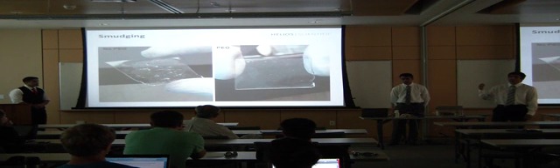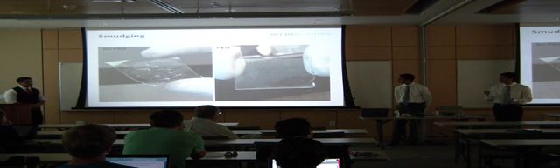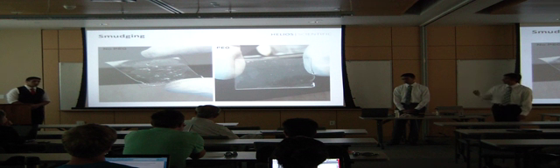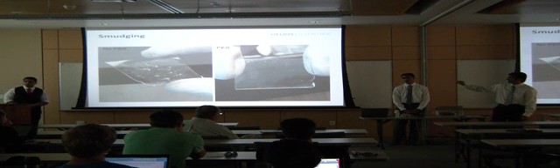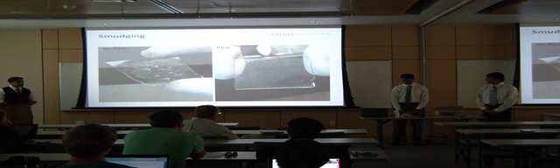So we also wanted to show that smudging doesn't have a great effect on the PEG slide as well. So we did a procedure where we smudged a non-PEG slide with ground beef. And as you can see, it smudged pretty well, and the surgeon would have to remove that out of the body so you would be able to see through there. And we did the same with the PEG slide. There's a little bit of smudging and residue on there, but there's not much. And this shows the PEG surface does not attach to this.